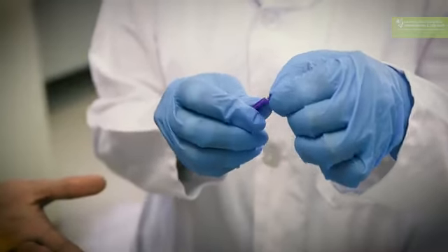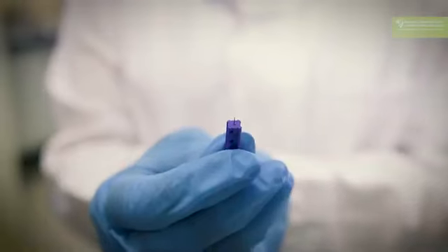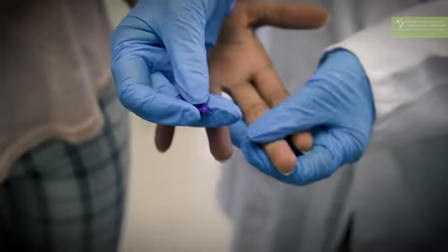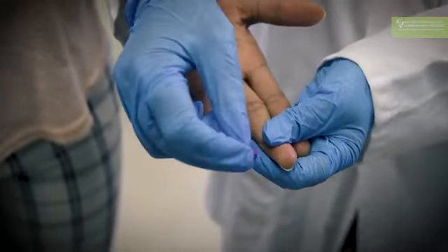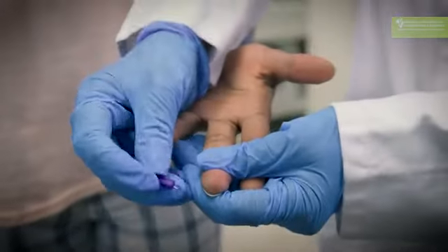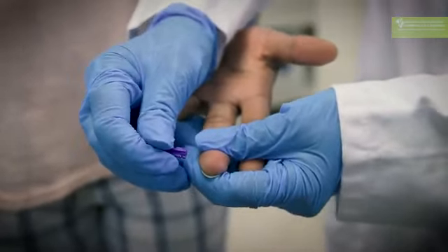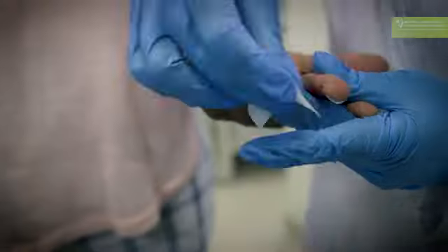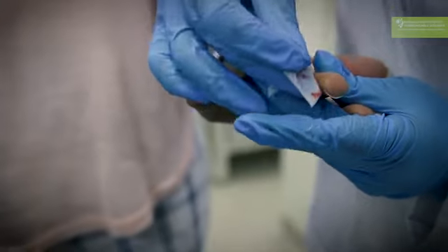You twist off the lid, and then you have the sharp needle. This needle is what you use to prick the finger. You're going to hold the finger pretty tight so you get the blood pooling. You never prick at the center, you prick off center, and you do it in one smooth movement. You wipe the first drop off.